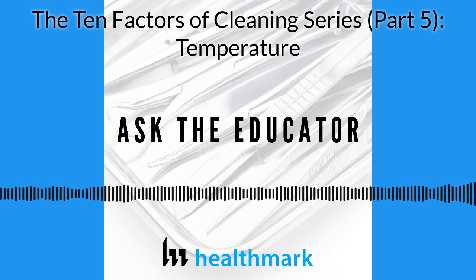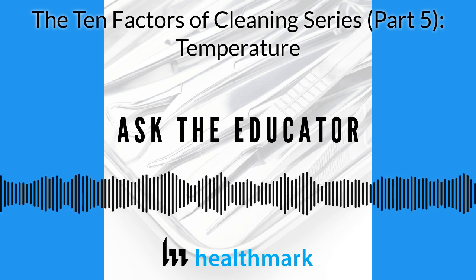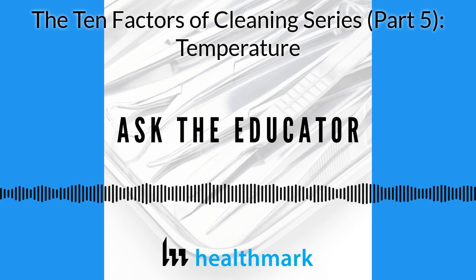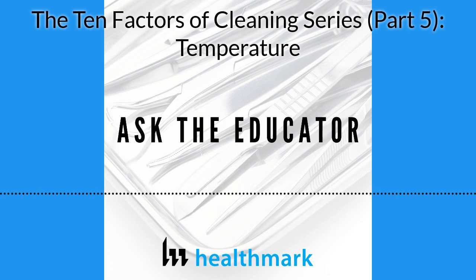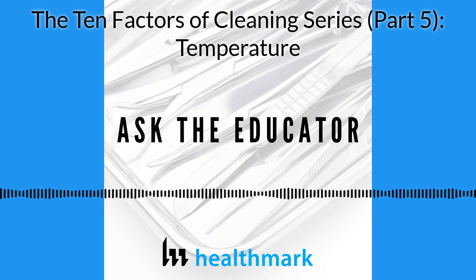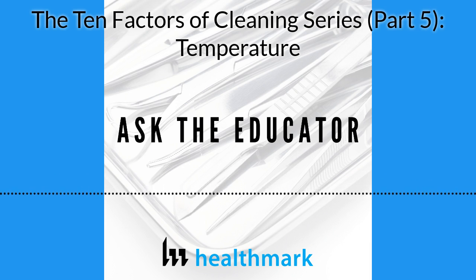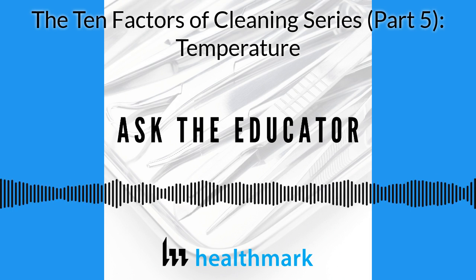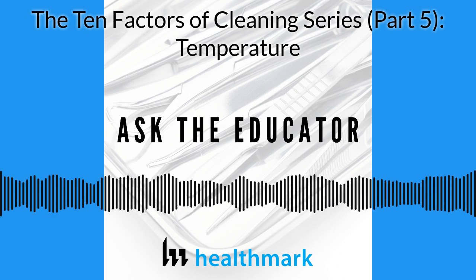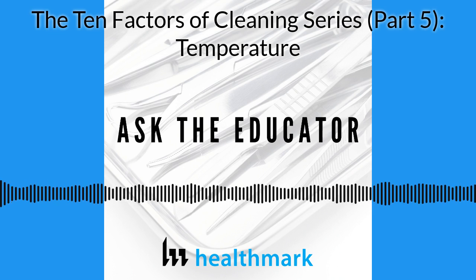And your automated washer, I know you could ask Ralph or Steve Basile or myself or Mark, in the early days when we were testing and the Tosi wasn't coming clean, we found out that the temperature was all off, and it was 120, 130 in the first stage where it needs to be cold water, and thus it was denaturing the blood that was on that test scoop on the surrogate device and making it harder to come off, and thus there'd be residue left. So there are ways to monitor it with data loggers and so on.